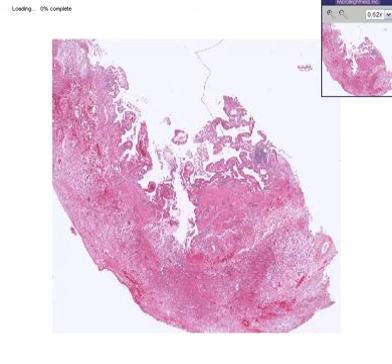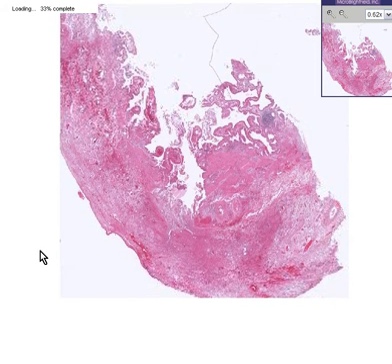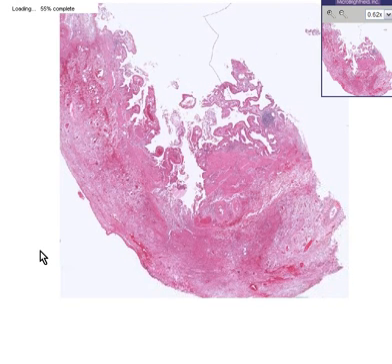Well, let's take a slide through that and put it under the microscope, and we might see something like this. And let's make this case as simple and as quick as possible. If you remember, in the last case we had chronic esophagitis, and chronic inflammation, as anywhere in the body, the chief cell of infiltrate is a lymphocyte or perhaps a macrophage or histiocyte. In acute inflammation of everything, in this case acute cholecystitis, the chief cell of inflammation is the neutrophil.